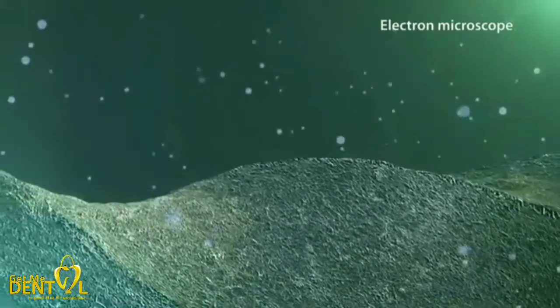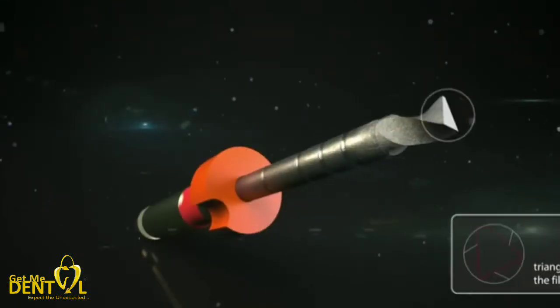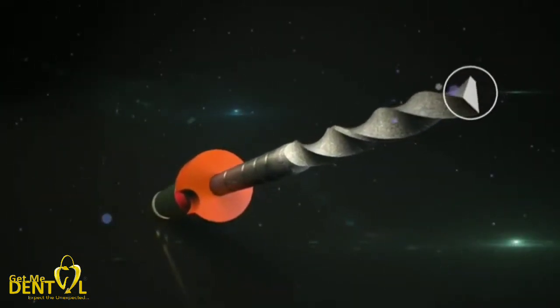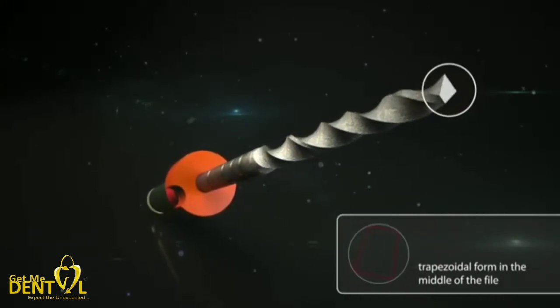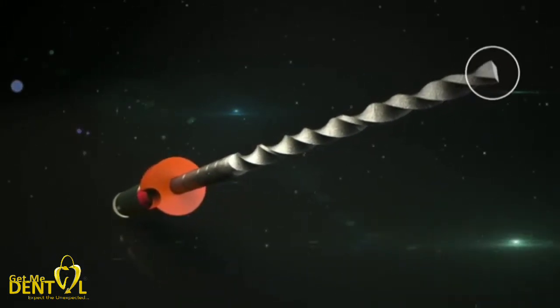Even newcomers to endo achieve reliable results quickly and easily with the aid of the HyFlex EDM. The innovative EDM process enables the internal cross-section of the file to vary extraordinarily. The almost rectangular cross-section at the tip gradually changes to a trapezoidal form until it approaches a triangular shape further up the file. The decreasing taper towards the top contributes to the extremely high breakage resistance, making it a reliable instrument even in tricky treatment situations.